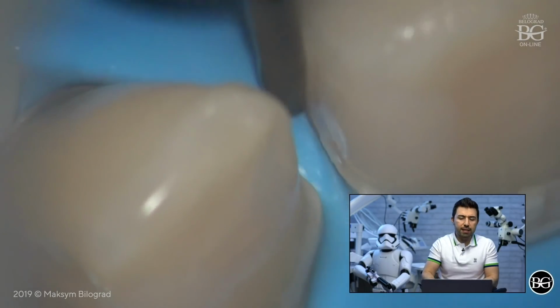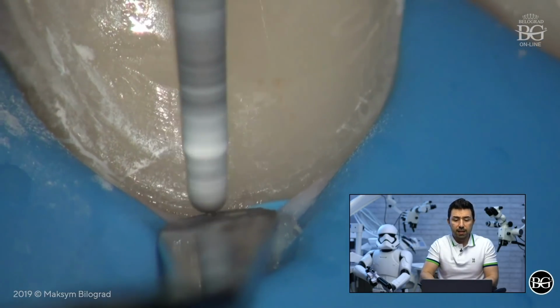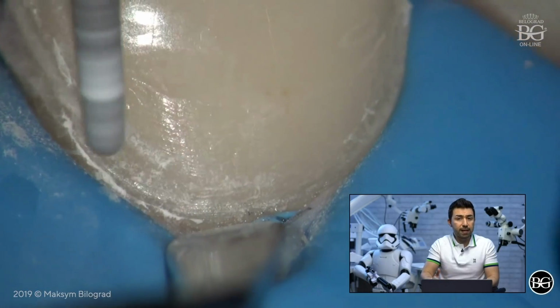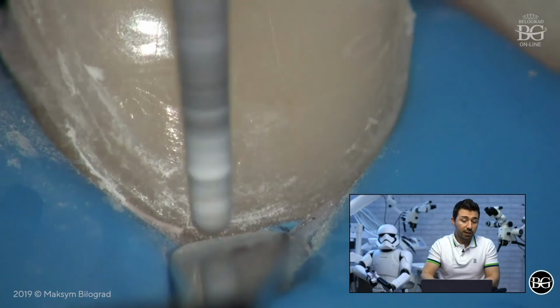I'm not trying to say that I'm placing rubber dam all the time to prep. For frontal teeth, we can prep with Optragate, for example. But if you have endodontic treatment and then you prep, or you have to do some fillings and then you prep, you can take this advantage to prep with rubber dam, and you will enjoy.